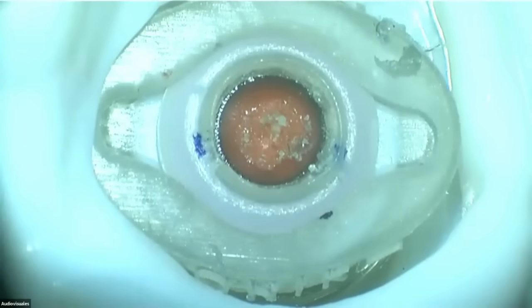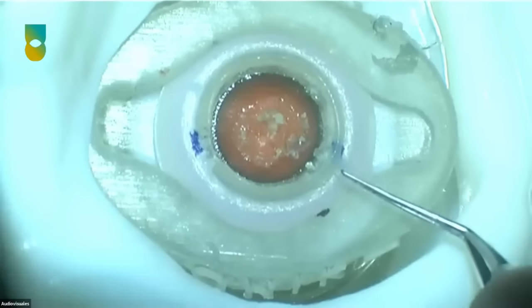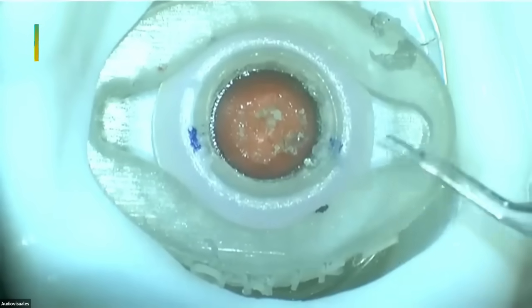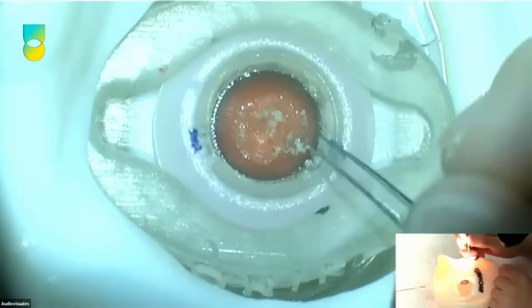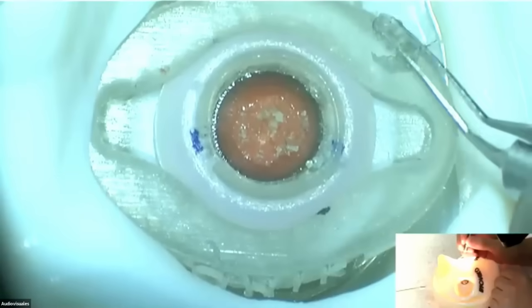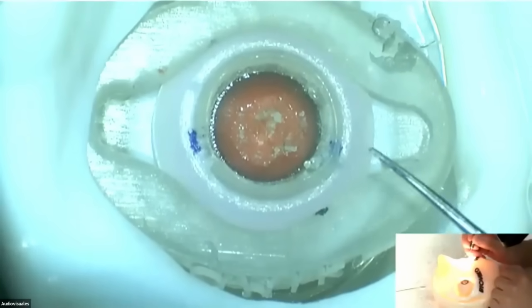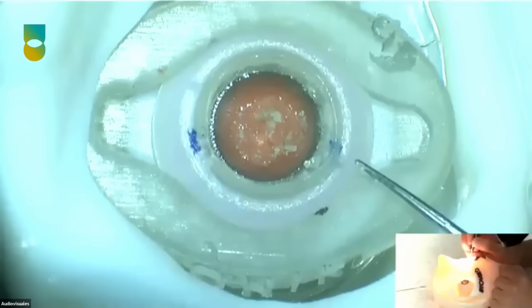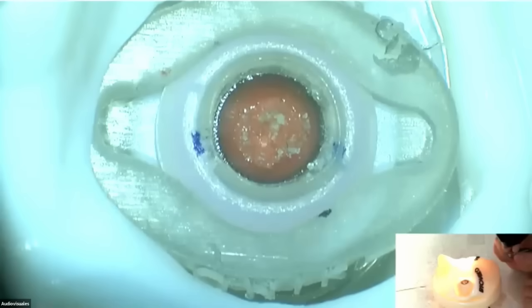And another important thing is that you have to think that if you go in the direction you want to go when you are opening the rhexis, sometimes you want to close it. It's going too open, too wide. You have to close it. You have to bring that one hand just in front of where you are, 180 degrees from where you are.